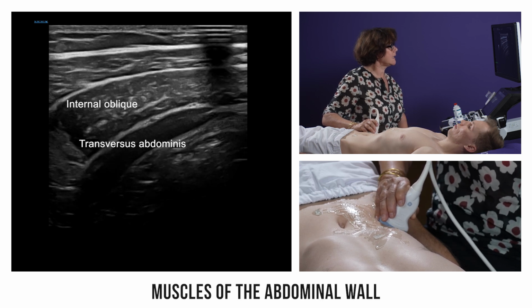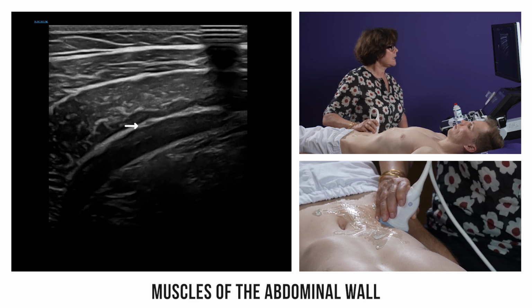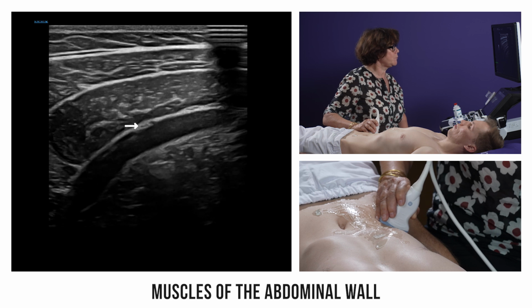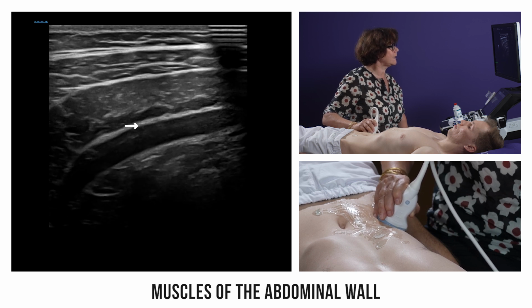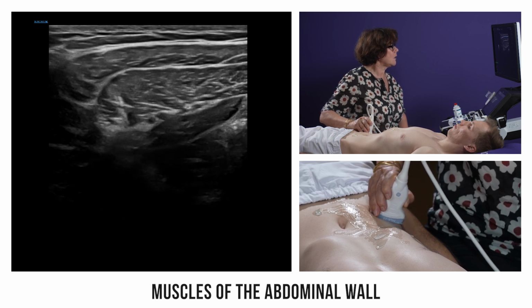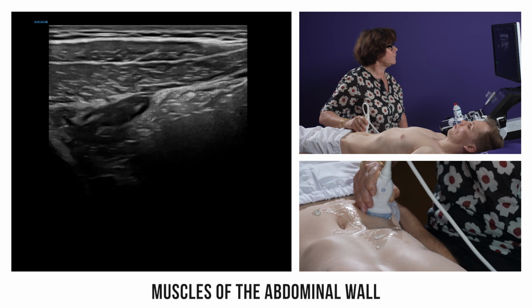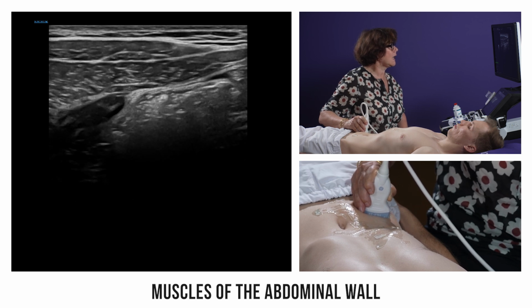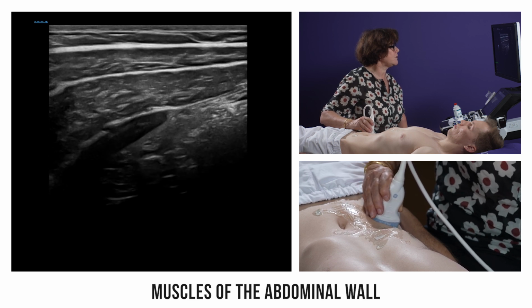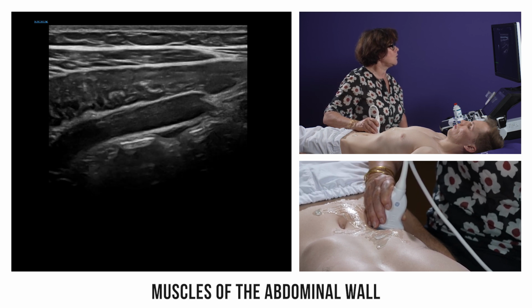More laterally, above the iliac crest, we observe the layering of these three muscles. Between the transversus and the internal oblique lies the anterior neurovascular bundle of the iliohypogastric nerve, which we can track as it passes about 1 or 2 centimeters medial to the anterior superior iliac spine, toward the abdominal wall. It gives off sensory branches that may mimic groin pain. Tracking upward, we can follow this small neurovascular bundle running between the transversus and internal oblique.